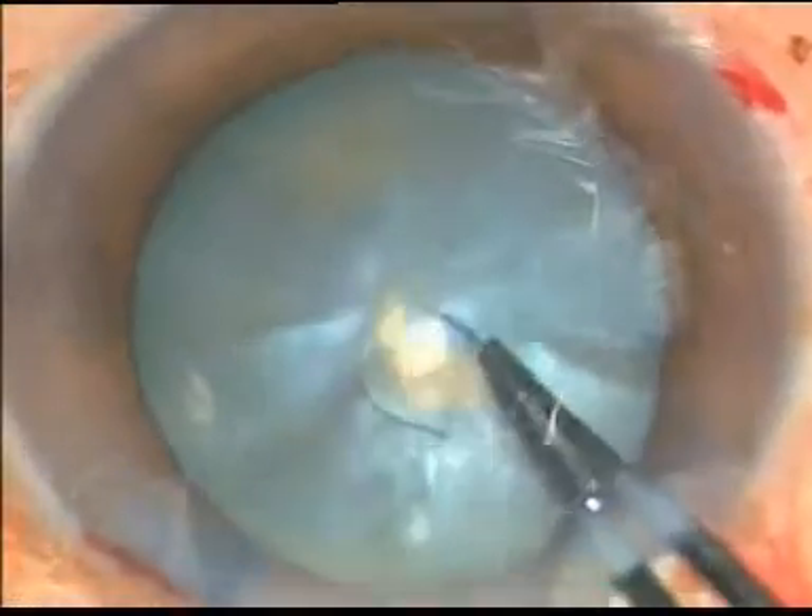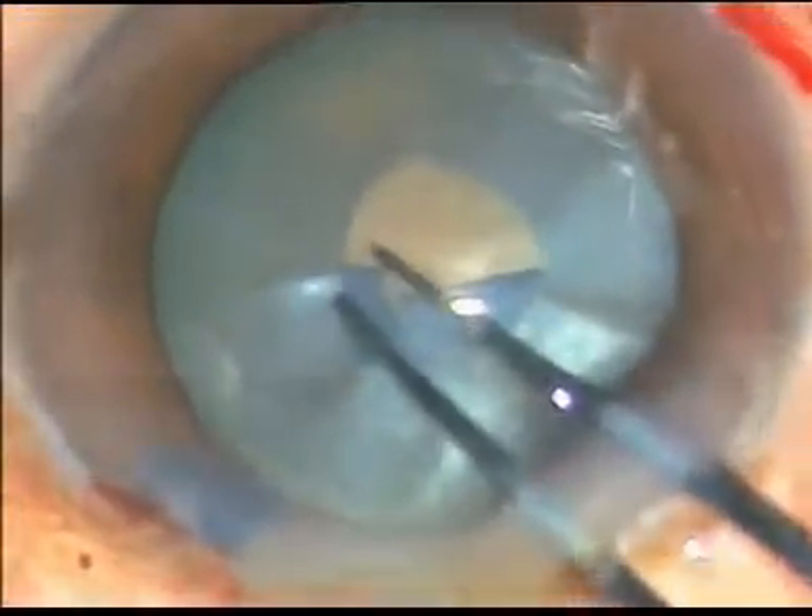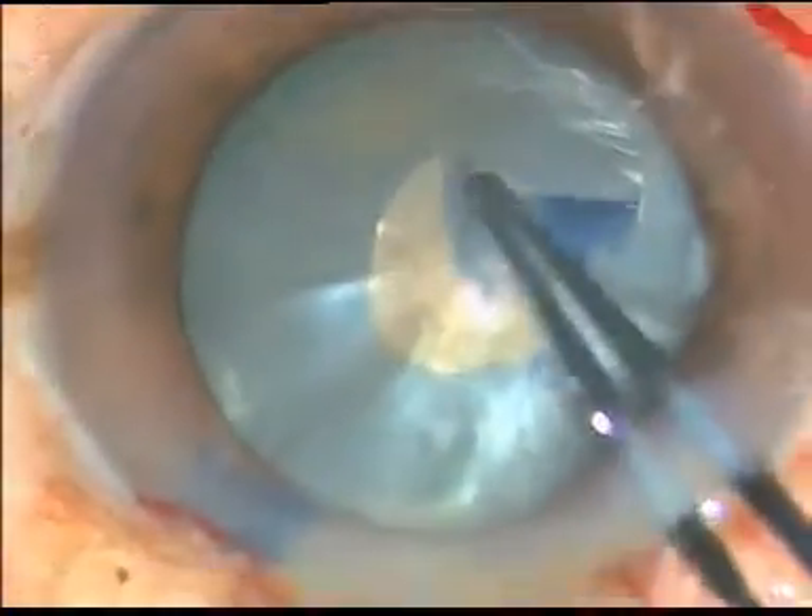Milky fluid is coming out, which means it is an intumescent cataract. Now I make a small rhexis with the help of a capsule holding forceps.